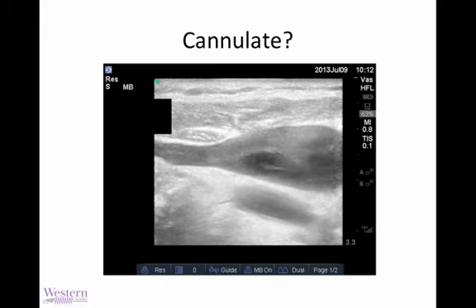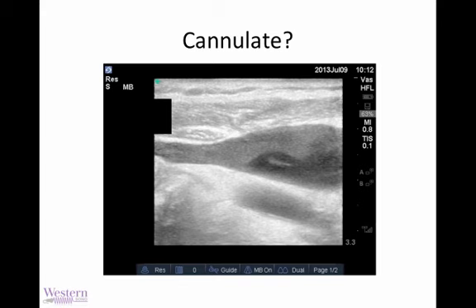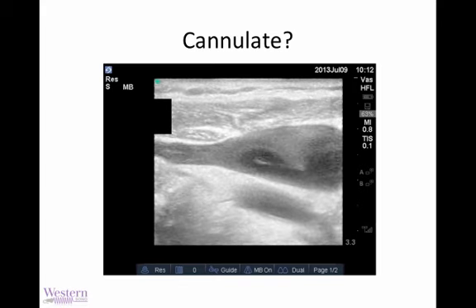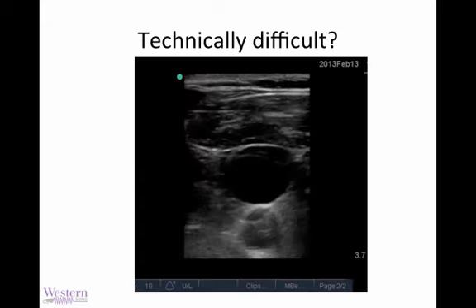When there's extreme turbulence in the vein, as in the case of, say, SVC syndrome or other unusual diagnoses, probably best not to stick thrombogenic catheters in the midst of a clot in process, as you can see here with the spontaneous contrast in the IJ.